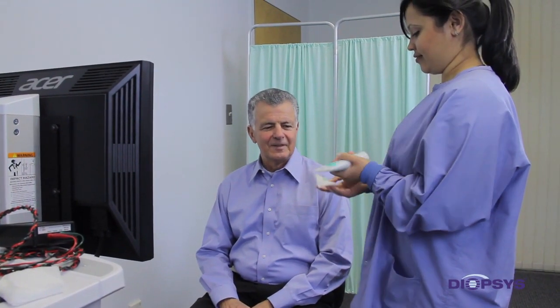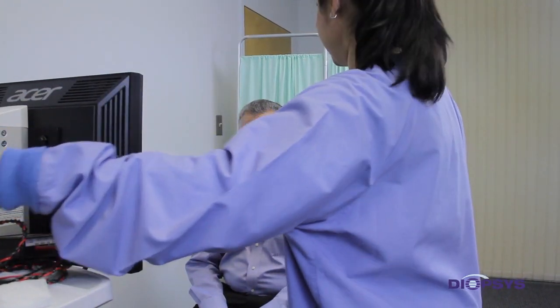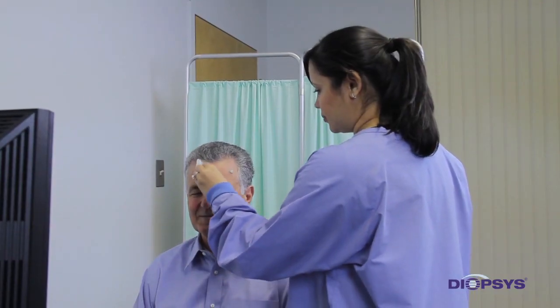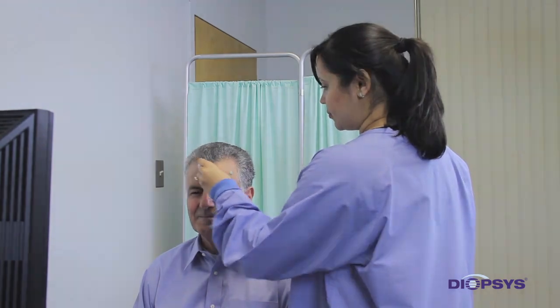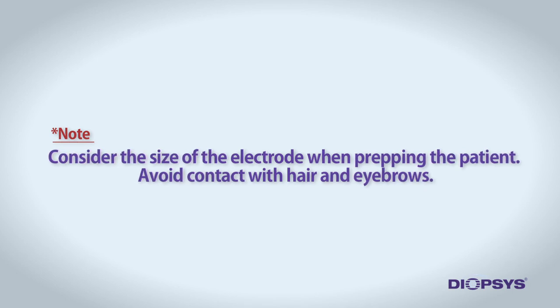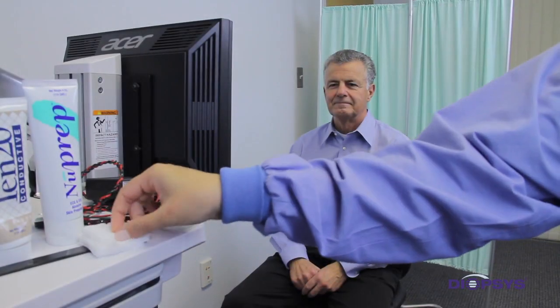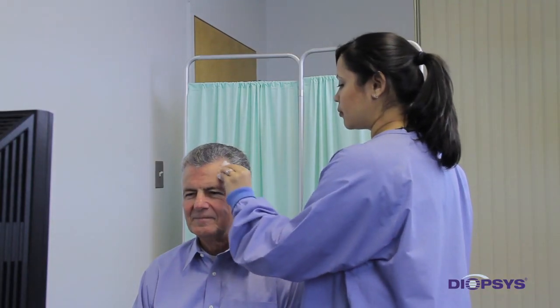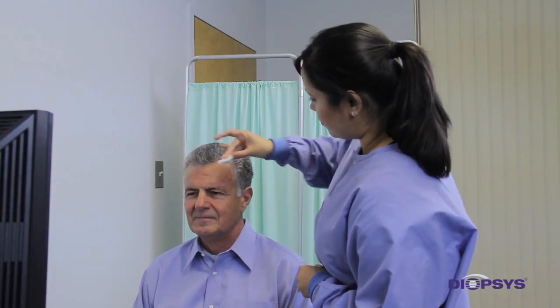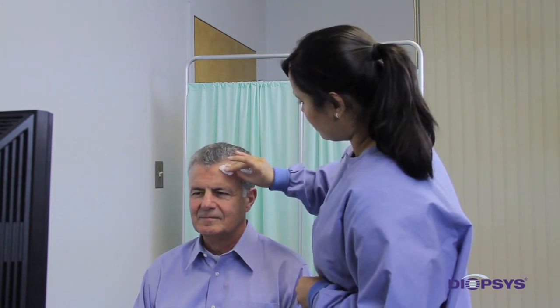Once the patient is comfortably seated, apply a pearl-size amount of NuPrep gel to a clean gauze pad. Rub the gel onto the skin on the center of the patient's forehead just below the hairline with moderate pressure using four to five small circular motions. Be sure to consider the size of the electrode when prepping the patient — the electrode should not come into contact with the hair on the forehead. Place another pearl-size amount of NuPrep gel onto an additional clean gauze pad and rub the gel onto the skin just above the temple area on the side of the forehead using four to five circular motions. Gently remove all remaining gel thoroughly with a dry part of the gauze.